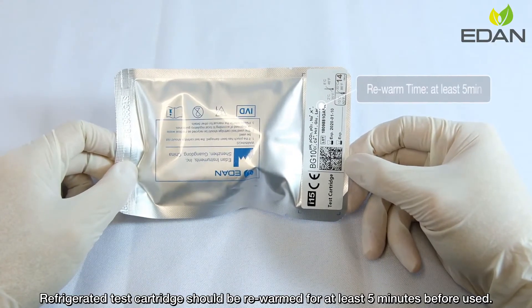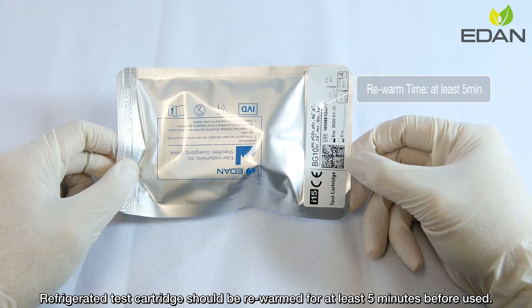Refrigerated test cartridge should be rewarmed for at least 5 minutes before use.